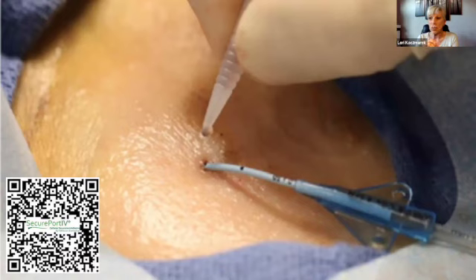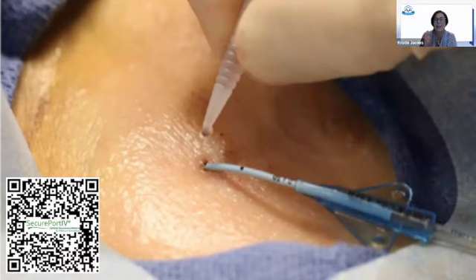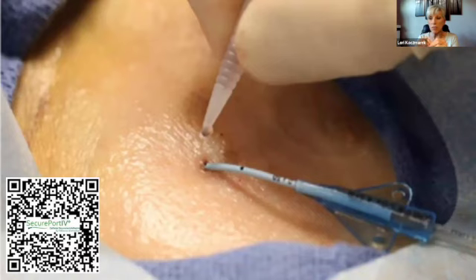There are some technology modifications on some products, and again, I'm not going to be able to speak directly to them, since I don't work for these products. But I think one of the big challenges I know from when I was doing vascular access is that you'd have that bleeding line, and you'd have to take that product off within 24, 48 hours. There's some added protection on some of the products that help keep the microbe load down, but again it's not sealing the site, and it's still going to need to be taken off. And when that's taken off, that line is at risk for bleeding or rebleeding, as I call it.